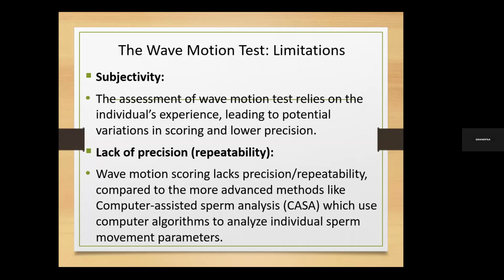All right. Especially as opposed to, in the tail end, we're going to do CASA. CASA is computer assisted sperm analysis. I'm sure that some of you will end up somewhere in other developed countries where semen analysis is even automated. The automated method for semen analysis is the computer assisted sperm analysis, which is called CASA. In those circumstances, because it's computer generated, everything is specific. That's where they can talk about motility of 32%. But in our case, you can't get 32%. You're always making an estimate.